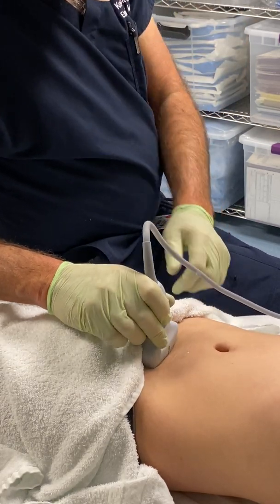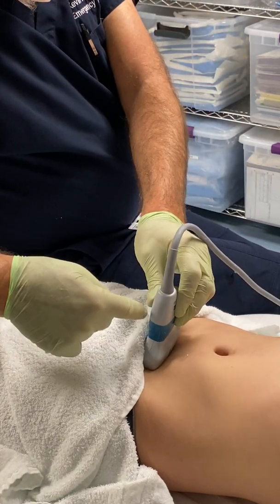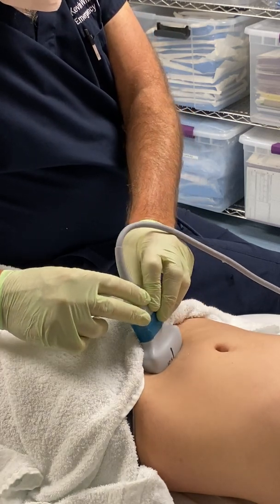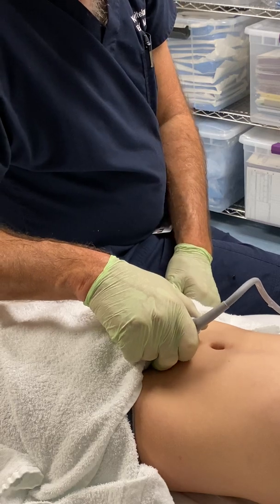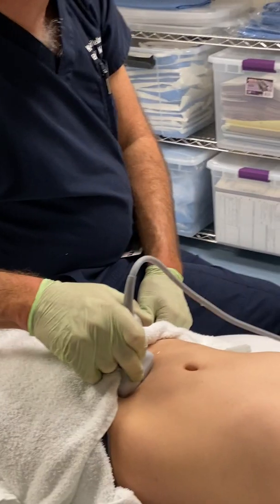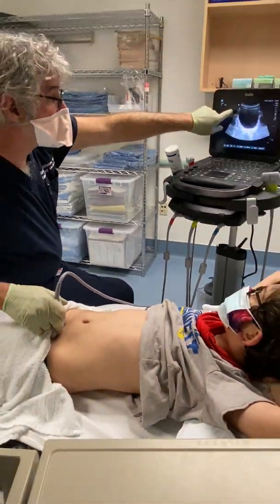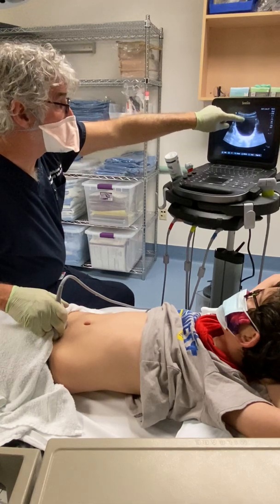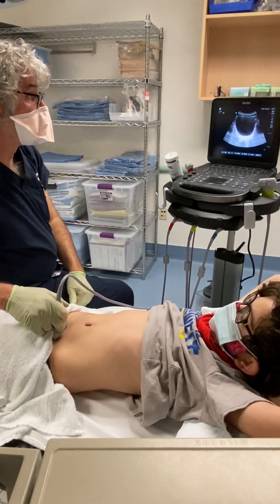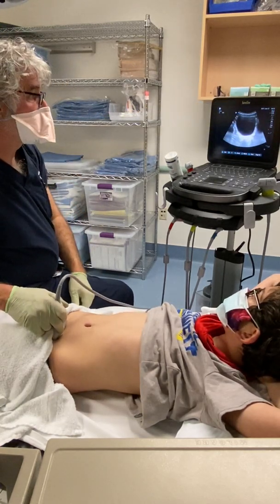You'll fan the probe — meaning moving it sideways this way, tilting it down — that's called fanning. In doing so you'll see the bottom of the bladder and the top of the bladder. What you want to do is get a picture of the bladder right when it's in the mid position, which has the widest and deepest measurements. That's going to give you the most accurate measurements. The bladder isn't round — it's more rectangular — and that's normal.